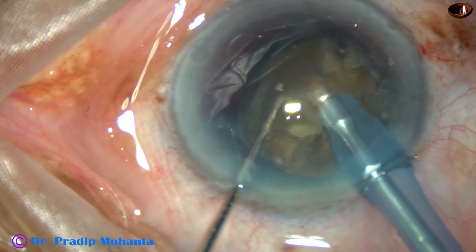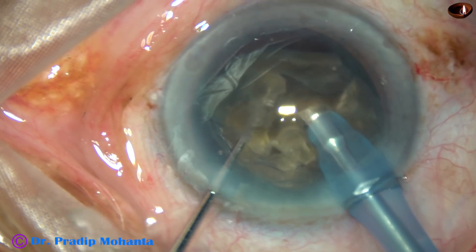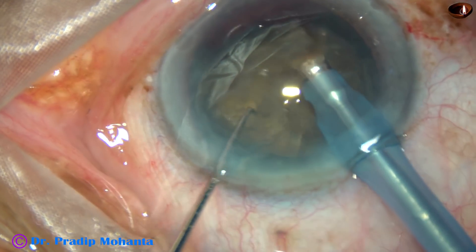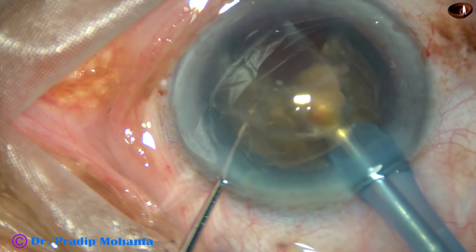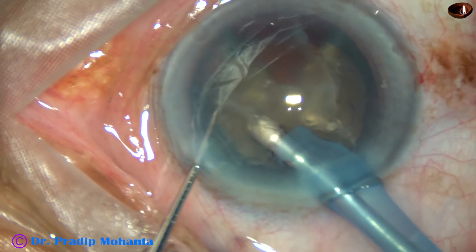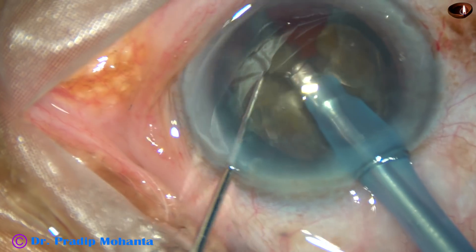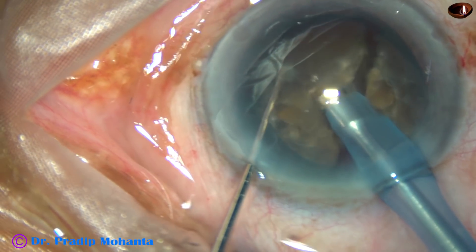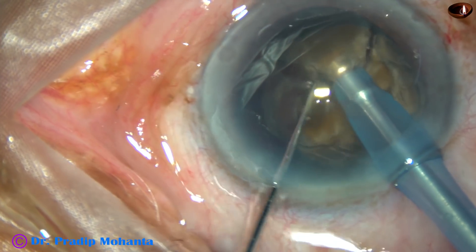Each fragment is emulsified. In this case, I did not tilt the triangular piece and just started emulsifying. This may be the cause of posterior capsular rent which occurred in this case.